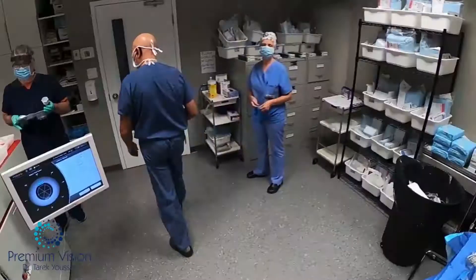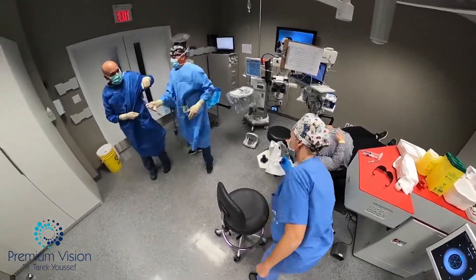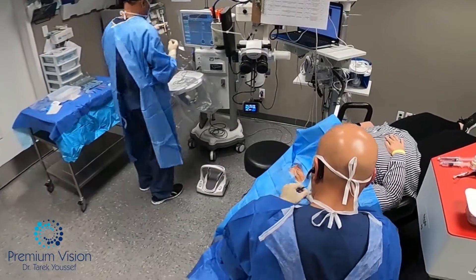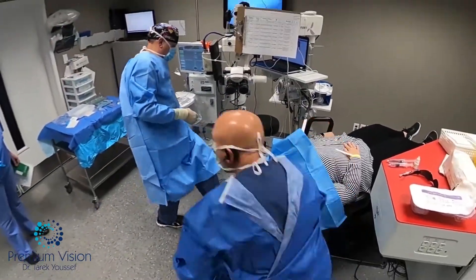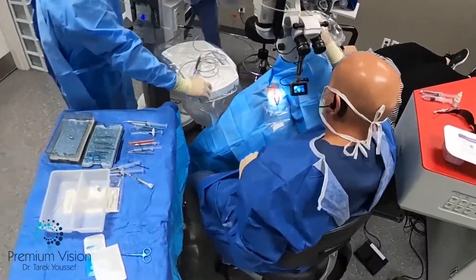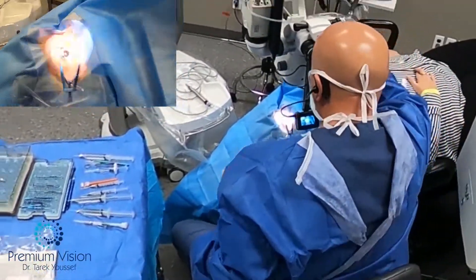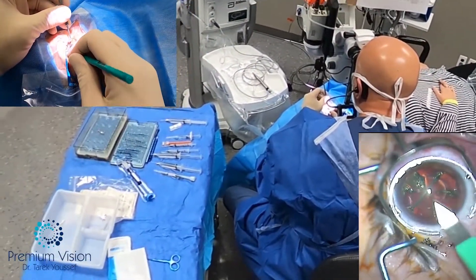I'm using the GoPro Hero 8. While I'm doing this, my scrub nurse is preparing the tables for the surgery — so there's no wasted time here. We do it in the same OR. Inserted the drapes, opened it, and inserted the lid speculum to keep the eye open. Started the GoPro, reviewed the lens and the white-to-white diameter. While I'm doing this, my scrub nurse is preparing the other table.